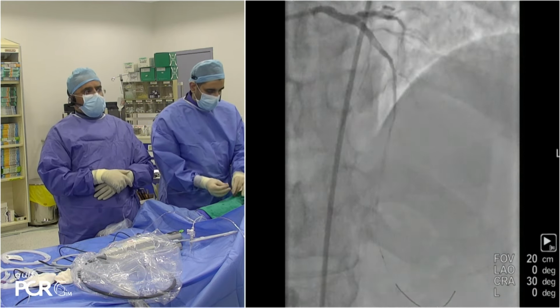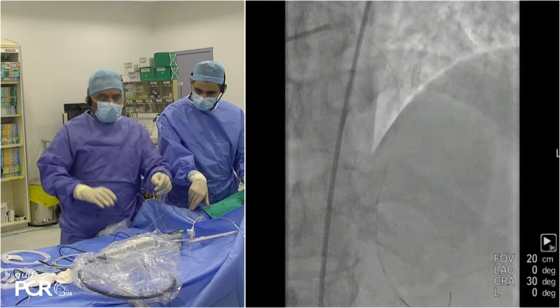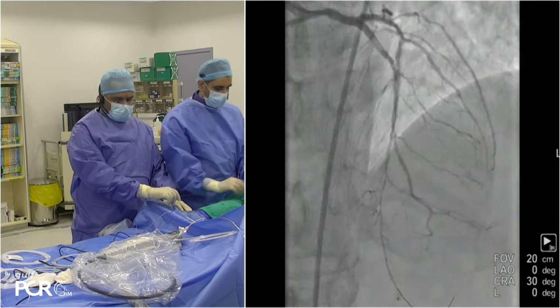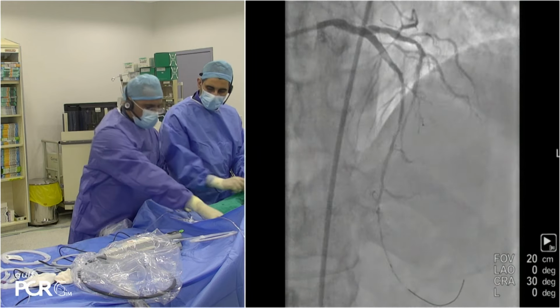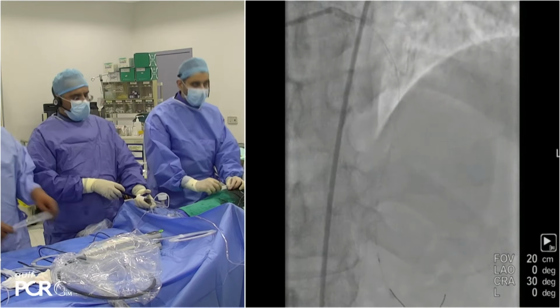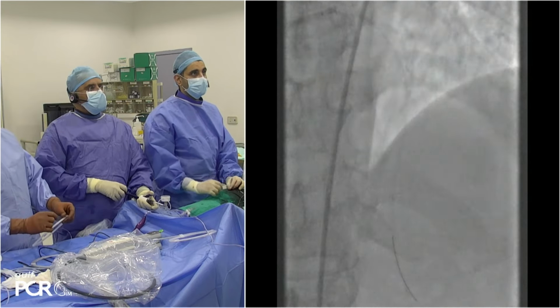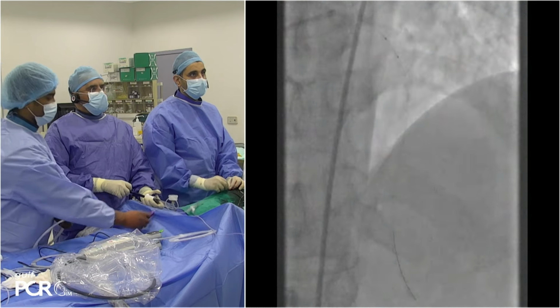So after the orbital and cutting balloon, we'll do another run of OCT. We want to see that the nodule has been shaved and the calcium has been broken. To your point, Dr. Ibrahim, we want to do all our calcium modification together, and then we'll repeat OCT. So we did the orbital, we're going to use cutting now, and we're going to use NC, then we're going to do the OCT, and then we'll see what we've achieved.